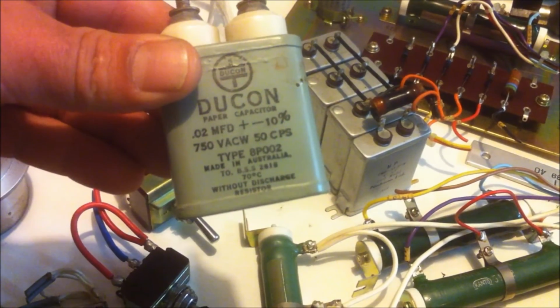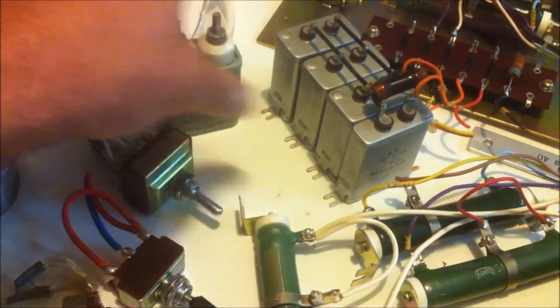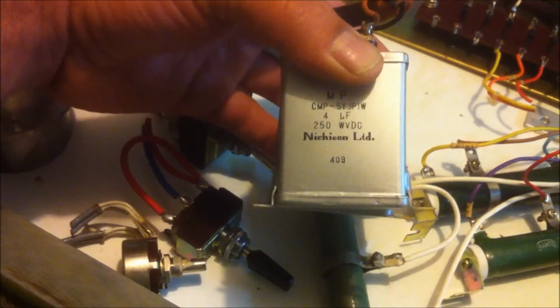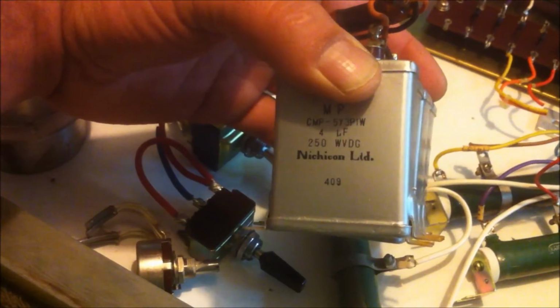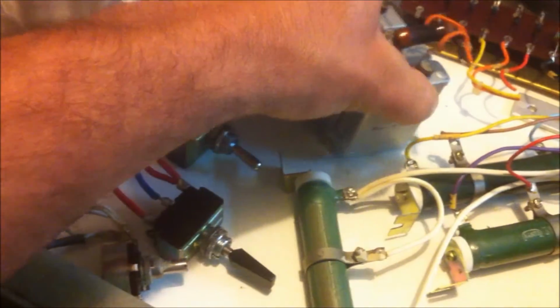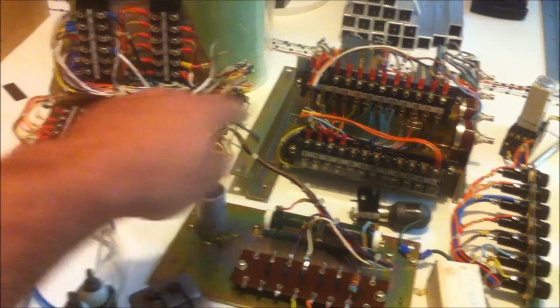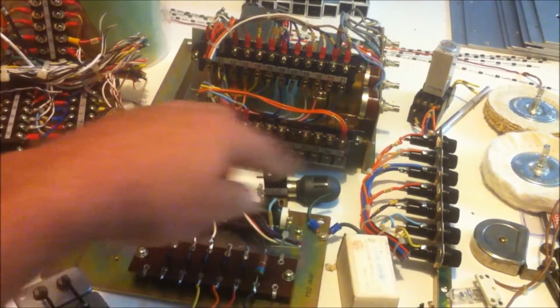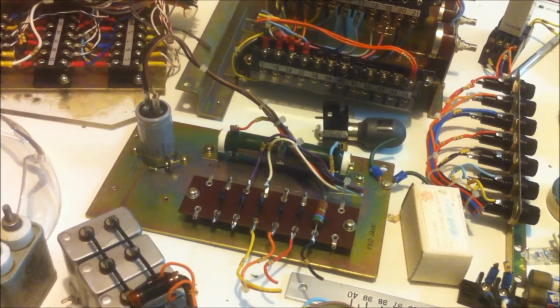This one here is a 750 volt AC 0.02 microfarad cap, and I also managed to keep these capacitors here as well. They're 250 volt caps. The one at the front there is a 4 microfarad, the other three are 8 microfarad caps. At the back here we've got a bunch of terminal blocks here, more terminals, another board with some diodes on it and a resistor and a capacitor.